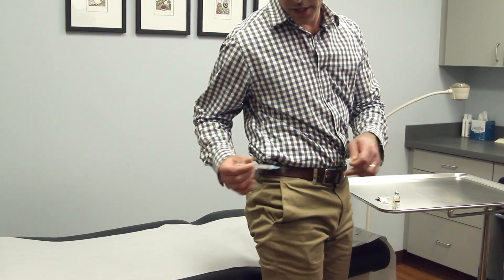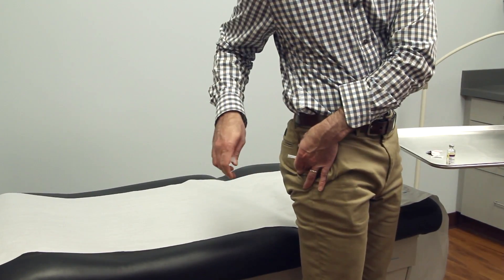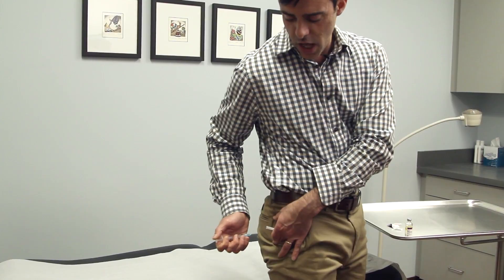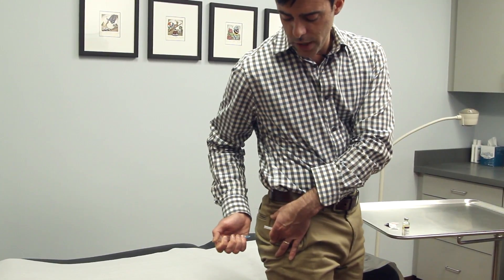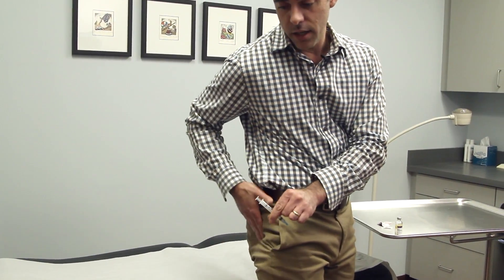You are going to do the upper outer quadrant of the glute. This takes some dexterity, but you want to do the same exact thing: cleanse with some alcohol, spread the fat layer, enter into the muscle, pull back slightly on your syringe to make sure you are not in any blood vessels, and then push the medication all the way in. Once you have pushed in the medication, remove the needle, take a gauze pad and compress the area.